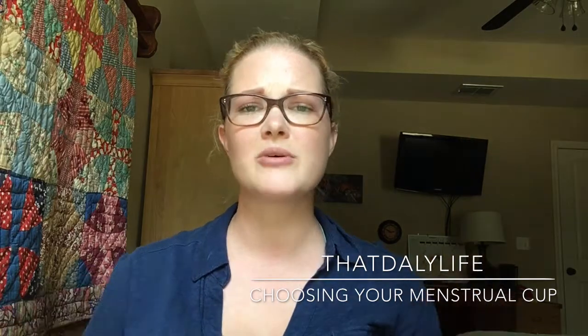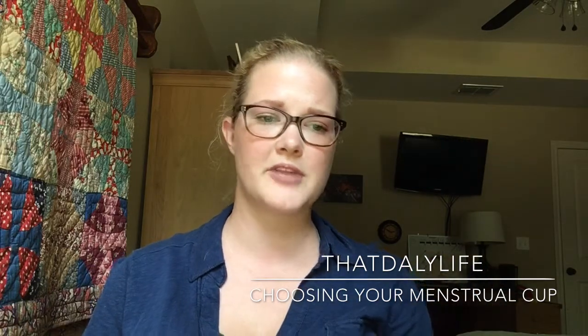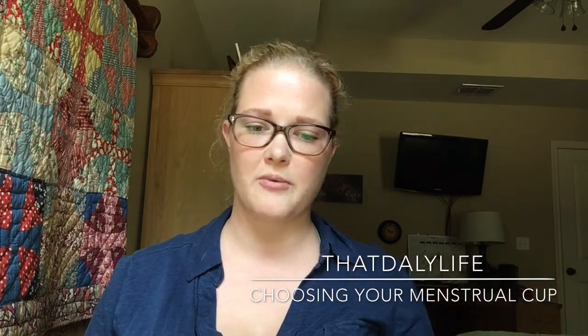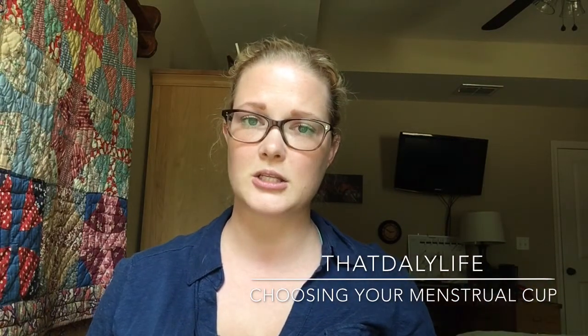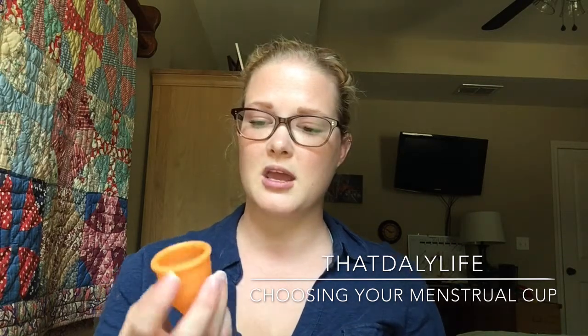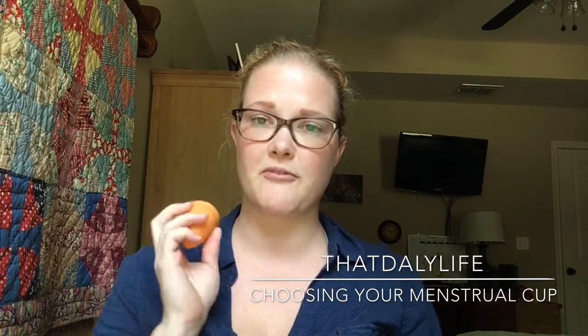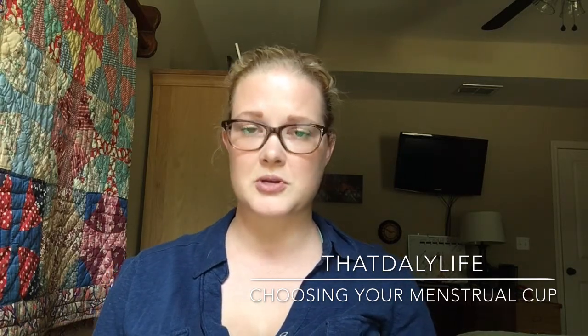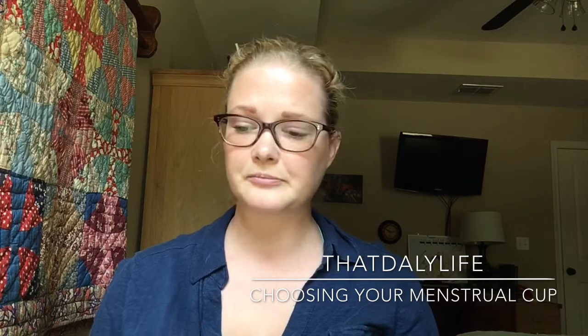So anyhow, once you've determined what type of menstrual cup you're going to want to choose, don't always go with the cheapest one, because a lot of them are made just all over. You're going to want to make sure you get one that's 100% medical grade silicone and from a reputable company. This one has been around for a while. It's got great reviews online, and I have to say I was glad that I purchased this one as my first menstrual cup.